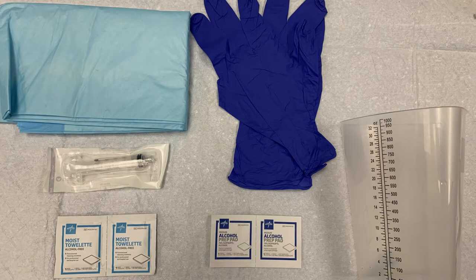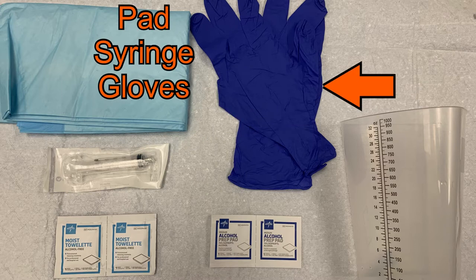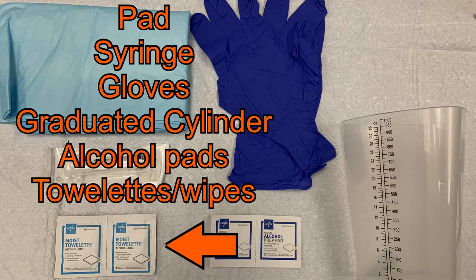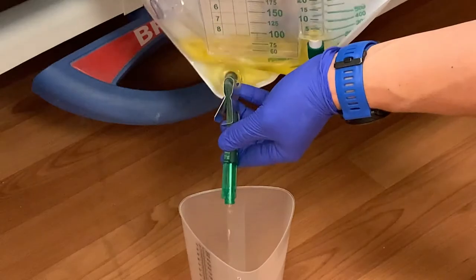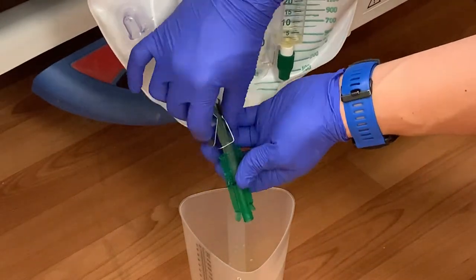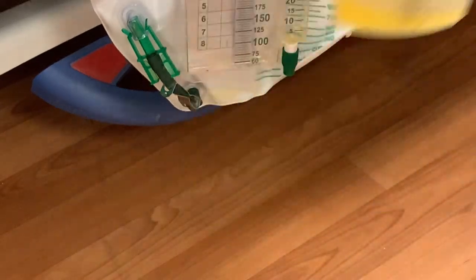Before you begin, you will need to gather the necessary supplies: a blue pad, a 10cc syringe, clean gloves, a graduated cylinder, alcohol prep pads, and moist towelettes or a pack of bath wipes. With the graduated cylinder, empty the Foley bag of any urine prior to removing the catheter. Take note of the amount so you can document it in the EMR when this process is complete.